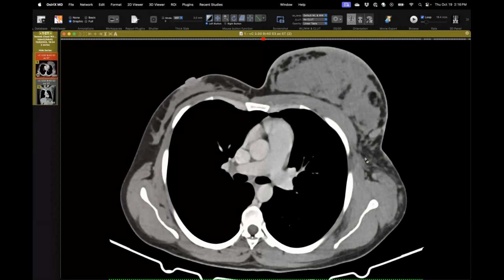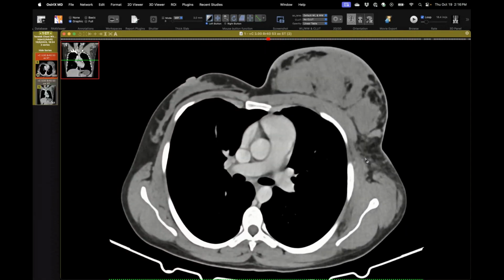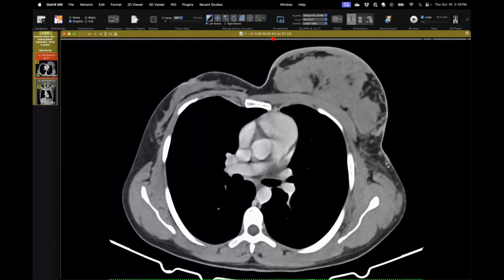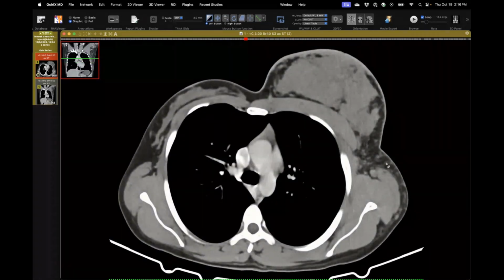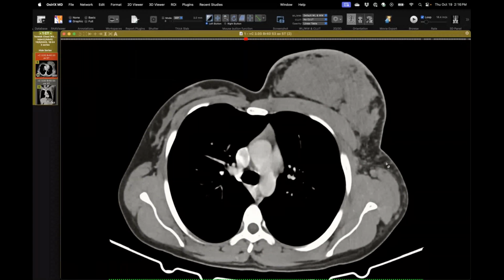I don't have any other imaging on it. The history is helpful in that the longstanding nature of it, but we don't often see something like this. But these are all dilated channels here in the axilla. And there's that, I always forget what it's called, one of those eponymous syndromes that can be associated with these lymphatic malformations, but just kind of a weird case of that.